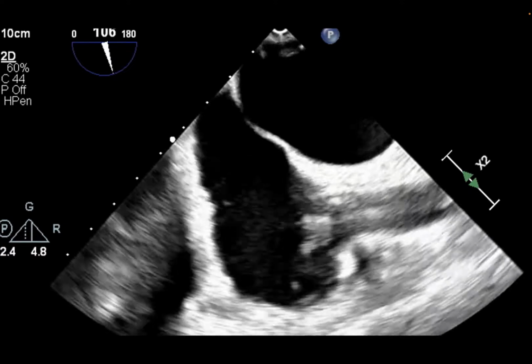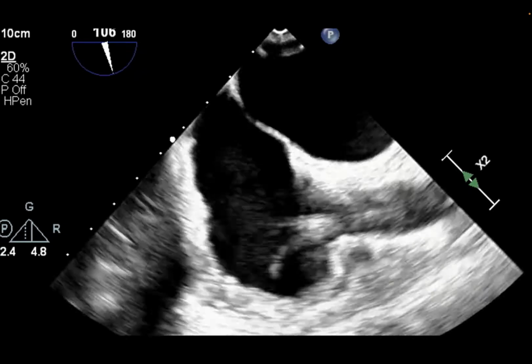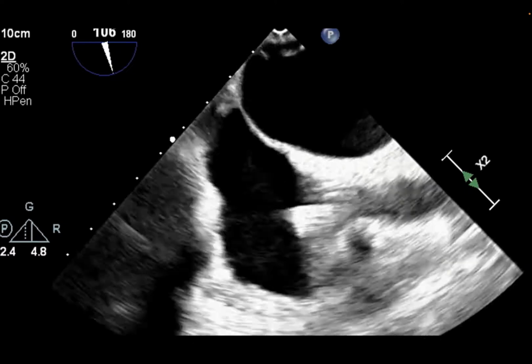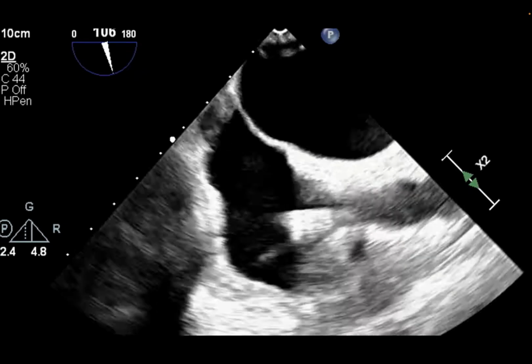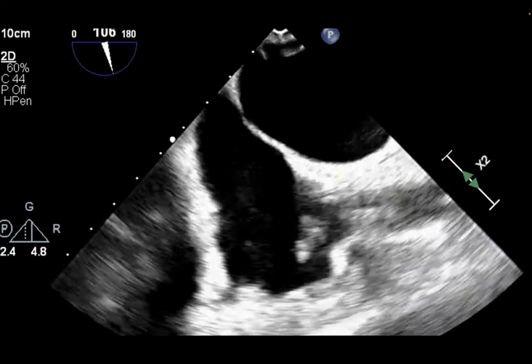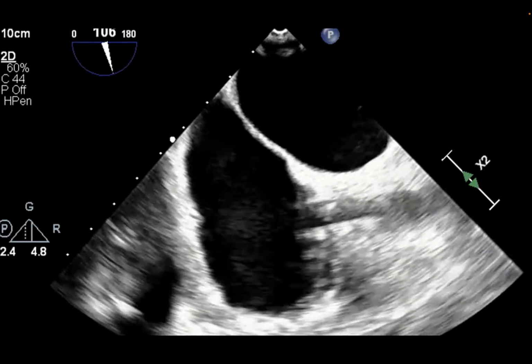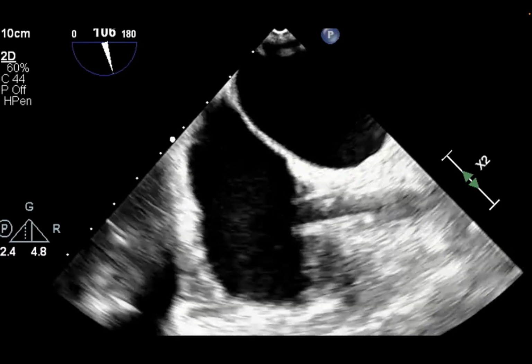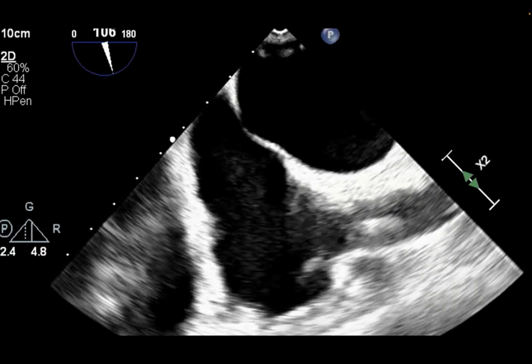So yes, I forgot to mention that this patient had an ICD and pacemaker placed a few years ago because of his depressed ejection fraction and arrhythmia risk. So this was a confounding thing in the right atrium, that is the presence of an AICD cable and pacing leads, and therefore there was a lot of traffic in this small real estate. It just makes the procedure that bit more difficult when you have all these extra leads in the right atrium, trying to decipher which is your transseptal needle, your sheath, and which is your pacing leads or ICD leads.